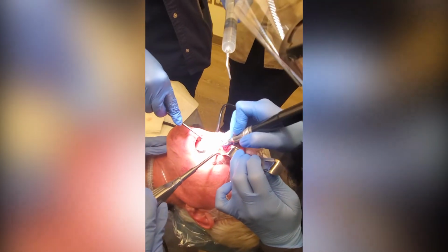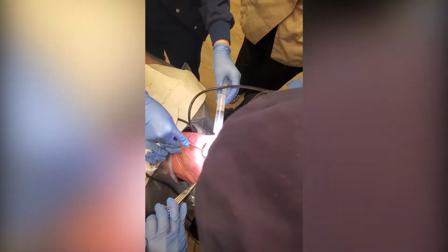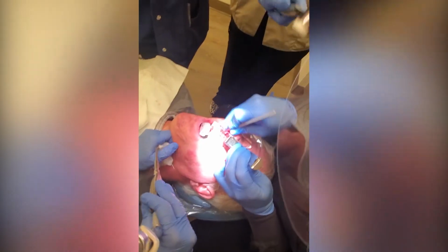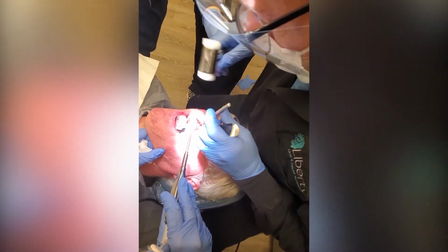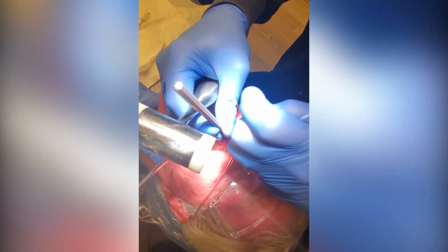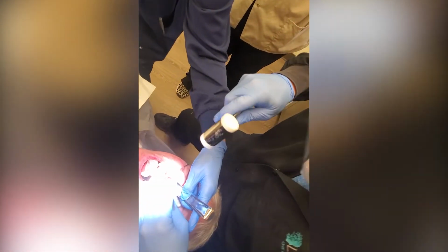Okay, this is the one where it's a little tighter between that root and this. Still a fair amount of space, but just a little bit tighter. You can't see it. You just have to go with where you know it's supposed to be. Tap, tap. Tap, tap. Move a little harder. This is pretty thick going here, so I'm going to grab all of this. I need someone to hold this so I can get in there. You want a suction on there so it doesn't get dusted.